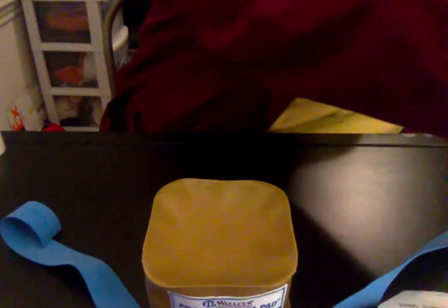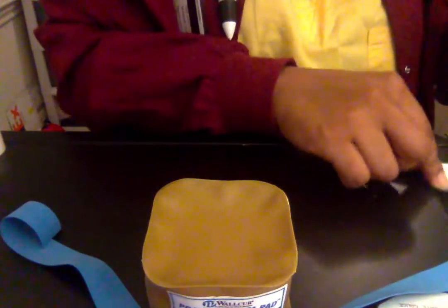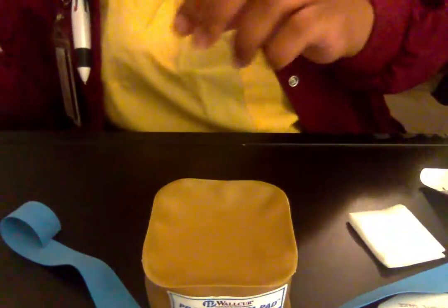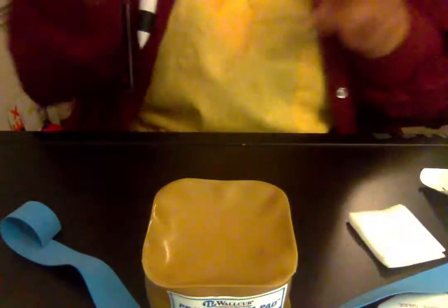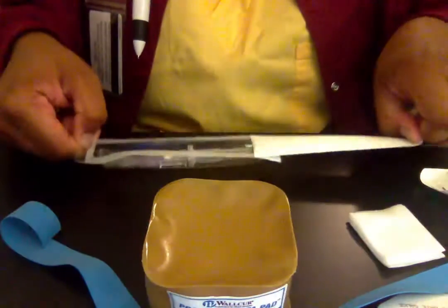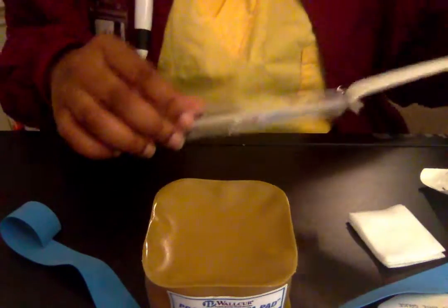I do have my saline syringe over here ready and prepped so that when I insert, I'm able to connect it onto there. I have some gauze just in case. And then make sure we open up the catheter. So, just have that over here and ready.